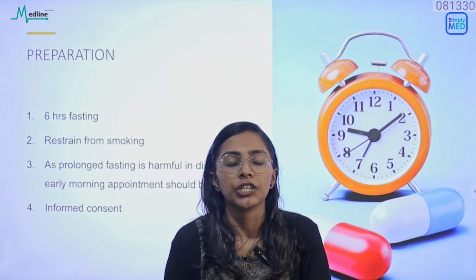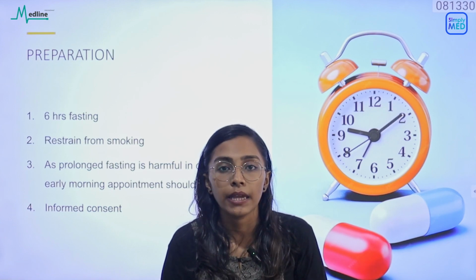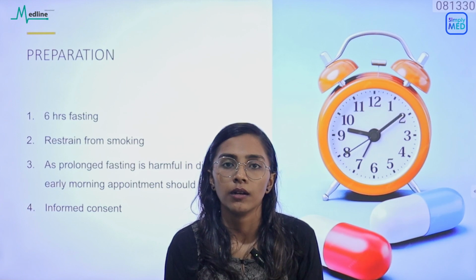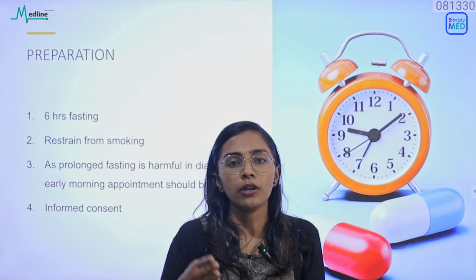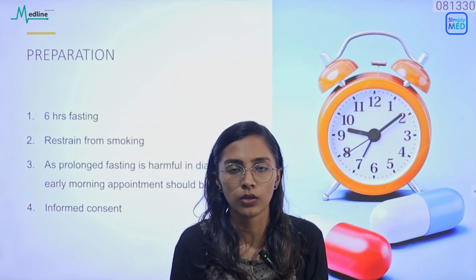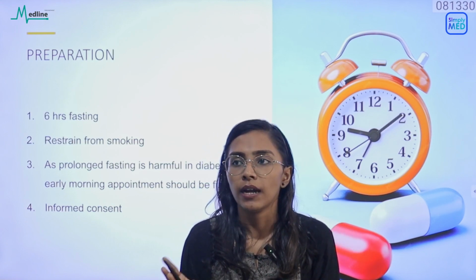Now, what is the preparation for a patient who's instructed to do a barium meal study? Do they have to prepare beforehand, or can they come as usual? They definitely have to go for some preparation. Before the examination starts, they have to undergo 6 hours of fasting. Normally 6 hours of fasting is advised.